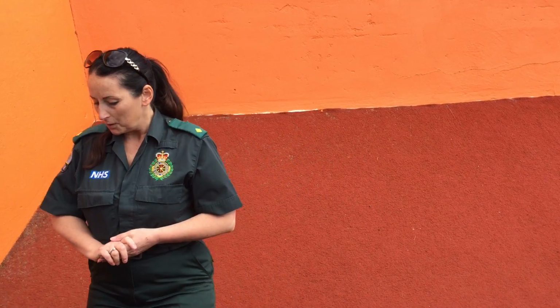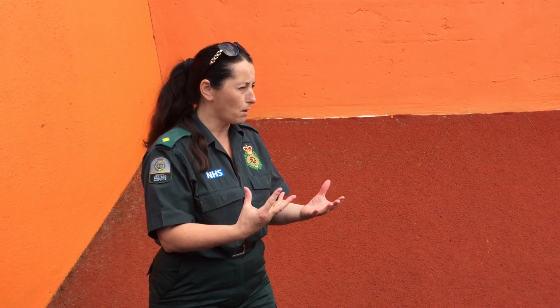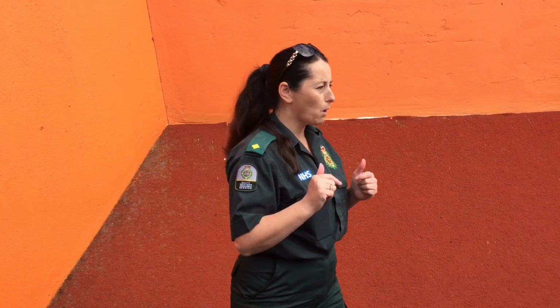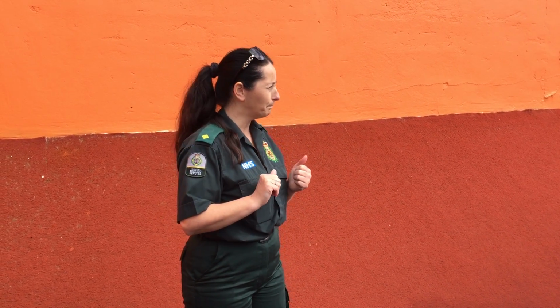Right, so you've been called to a patient, or you've come across a patient, and what are you doing as you are approaching the patient? What are you looking for? Danger, yeah, first thing. Make sure it's safe for you to approach the patient. No hanging wires, electric wires, no broken glass on the floor, etc. So as you are approaching the patient, what are you looking for? What are you going to try and get from the patient?